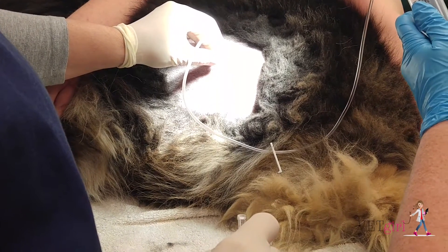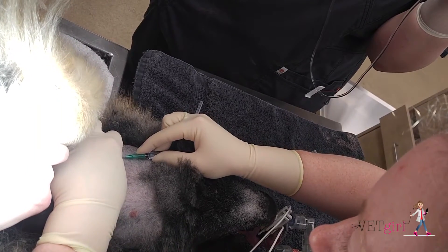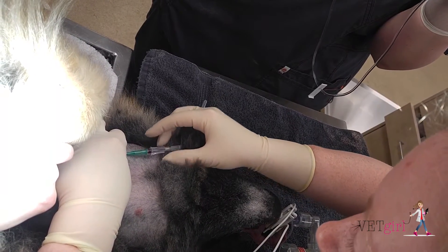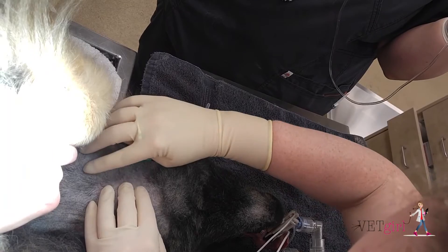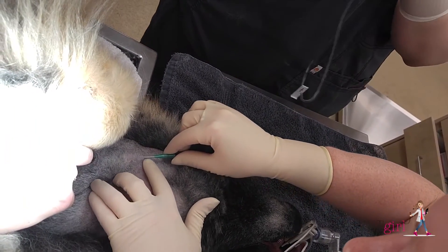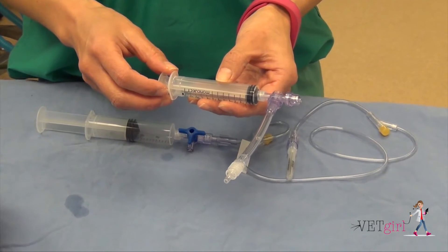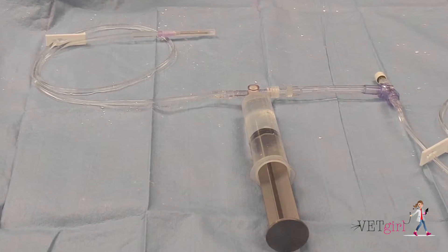The patient was placed under general anesthesia, and the skin over both the jugular vein and the thorax were clipped and prepared aseptically. Using a closed collection set, blood was collected directly from the jugular vein with a needle and syringe, and no additives were used. This was immediately injected into the pleural space, followed by a small amount of saline flush.